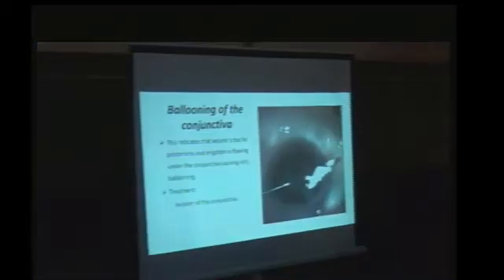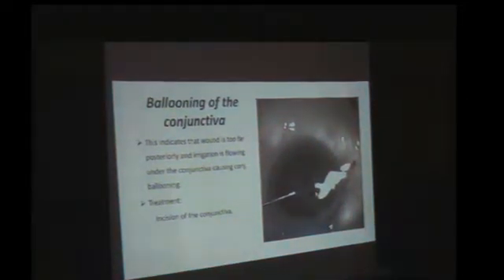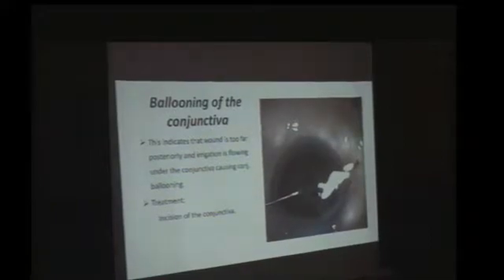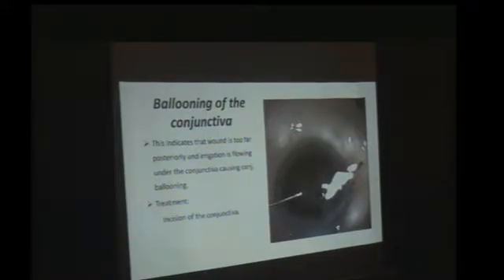طيب ballooning الـ conjunctiva، انت لو بتعمل الـ wound بتاعك دخلت posterior شوية وعملت injury للـ edge بتاع الـ conjunctiva في الـ attachment بتاعه للـ limbus، هتلاقي الـ fluid يدخل تحت الـ conjunctiva، يحصل ballooning الـ conjunctiva. هتكون النتيجة إيه؟ إن العين كلها تتملي fluid، يحصل reflections جامدة ما تبقاش شايف. ساعتها بتعمل incision في الـ conjunctiva عشان الـ fluid ده يطلع لبره، وممكن تعمل milking للـ conjunctiva وتعمل recession للـ conjunctiva لورا وتكمل الحالة بتاعتك.